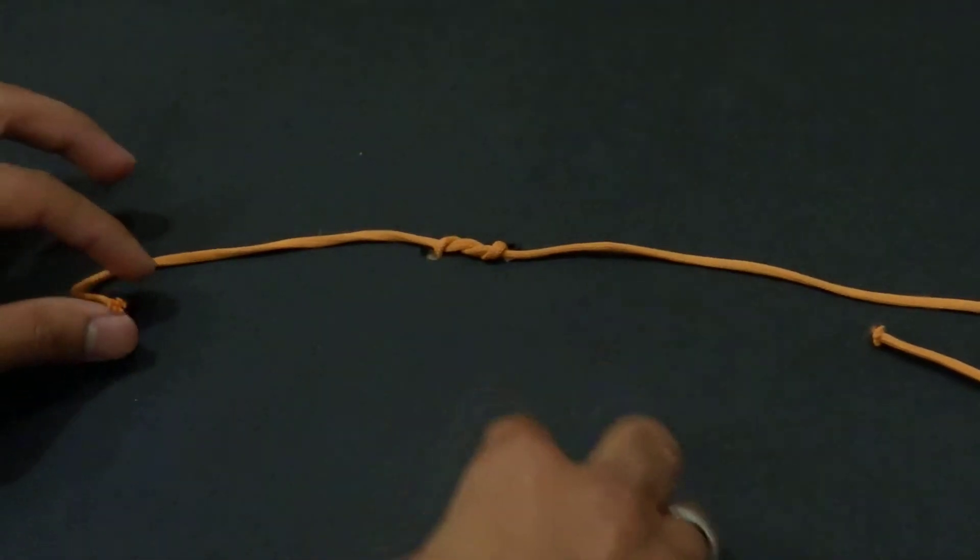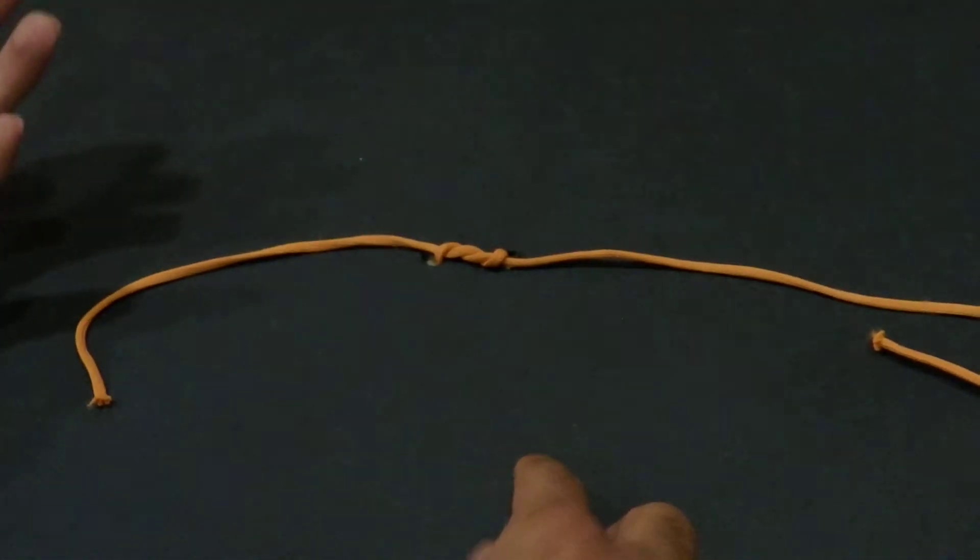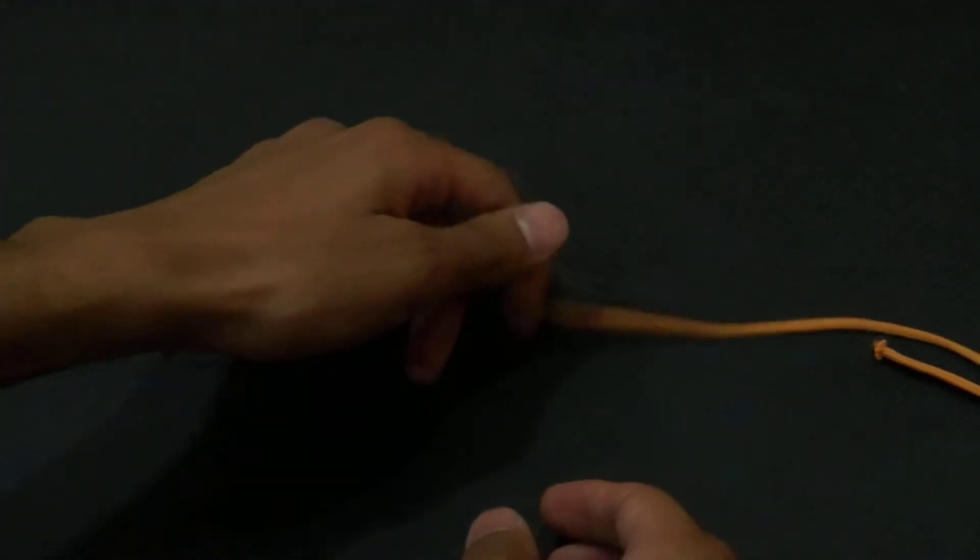Then go out and here go out. So I made a surgeon knot — one was done by the left hand and the other one was done by the right hand at the same time.